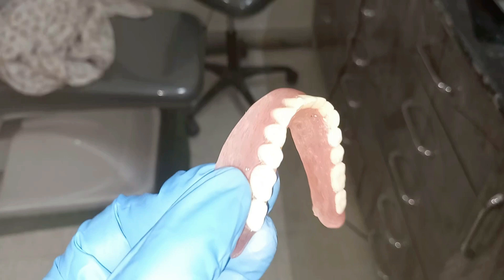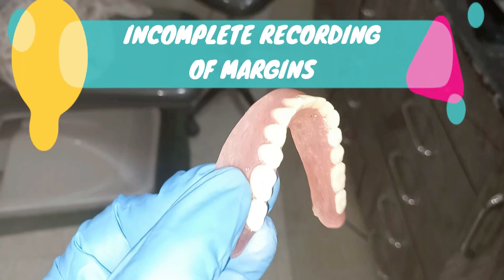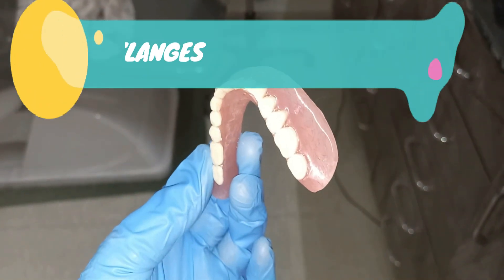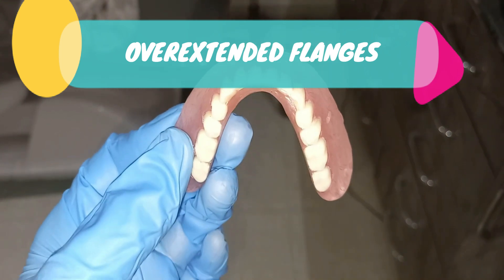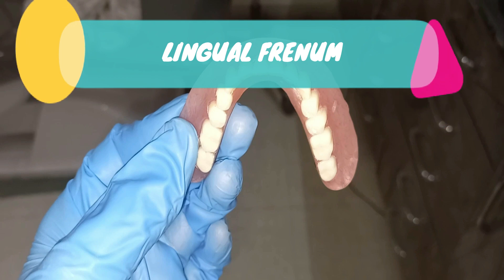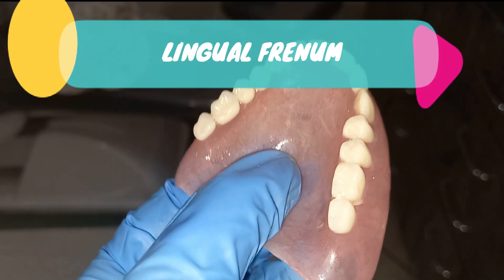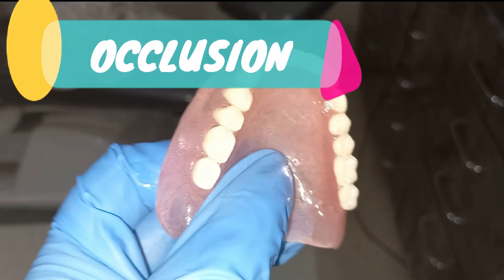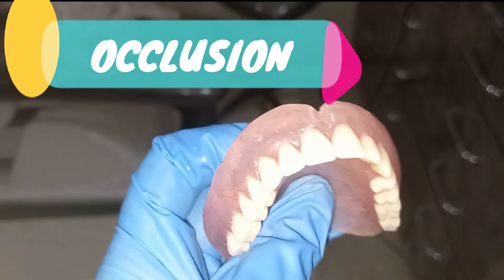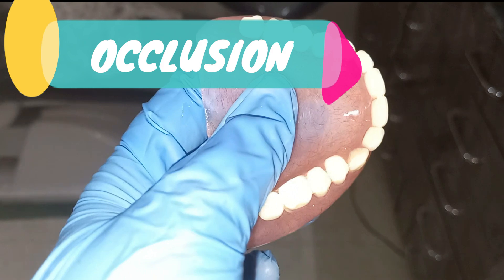If the denture is unstable, there are various reasons. First, the impression may not be good or the denture is not seated properly. Second, over-extended flanges. Third, always check the lingual frenum — if it is elevated, the denture will not be stable. Fourth, if the occlusion is disturbed, the denture will move when the patient tries to eat.